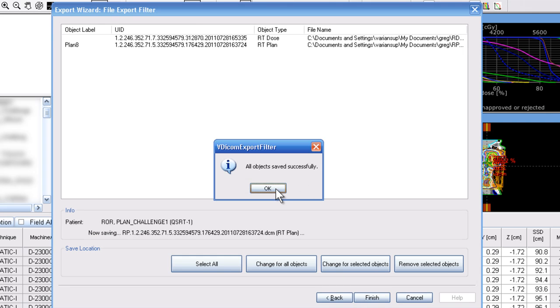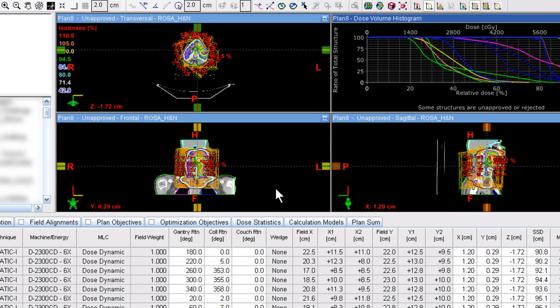That will save all of the objects in that folder. Then from there you will just navigate to that documents folder and zip the file up, and it will be ready for importing in through the ROR website.